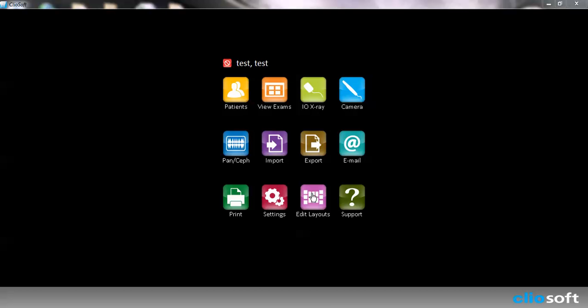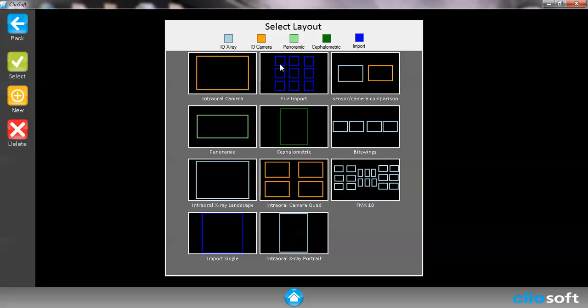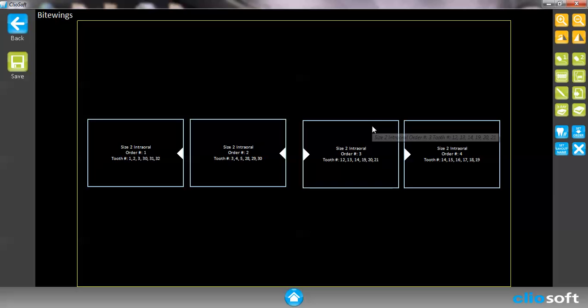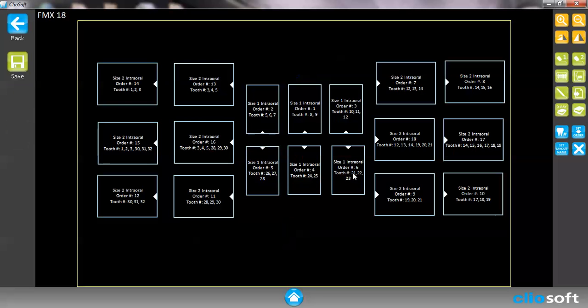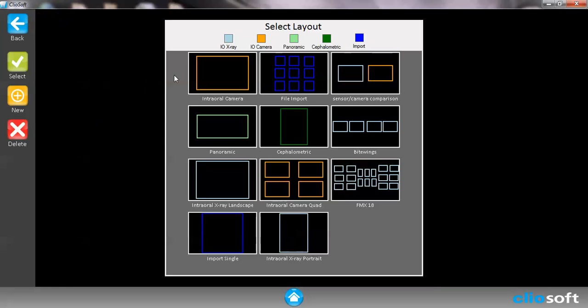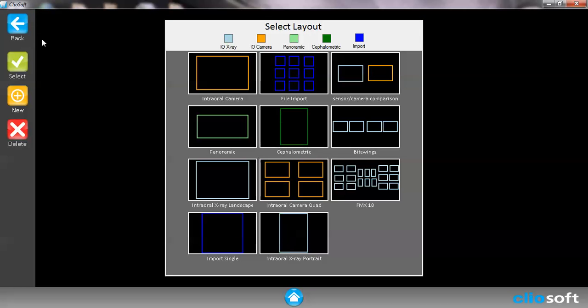We're going to browse over to the edit layout and once we are into this picture you'll notice that we already have several different layouts that are included in the ClioSoft. For example, we have ByteWing where I'll tell you the order number and we have FMX single images. If we wanted to make more images all we simply have to do is click on the new button.